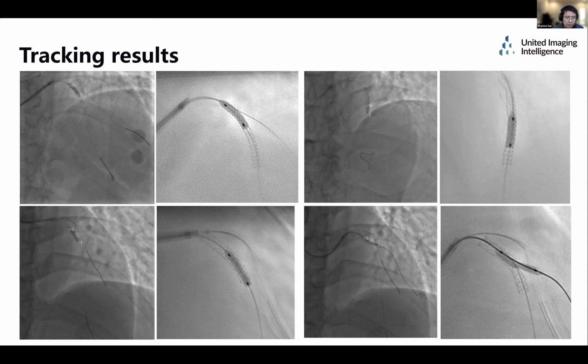Here, I give some examples, the tracking examples within the videos. From the video, we can see the landmark tracking result. Those small white circles just circle the landmarks. We can robustly track the small landmarks. And beside those videos, I just put the downstream task result.